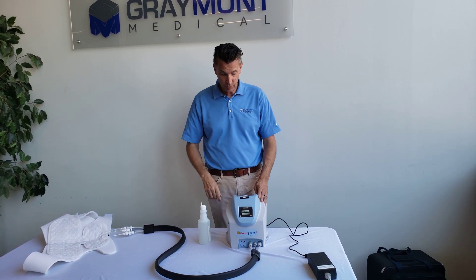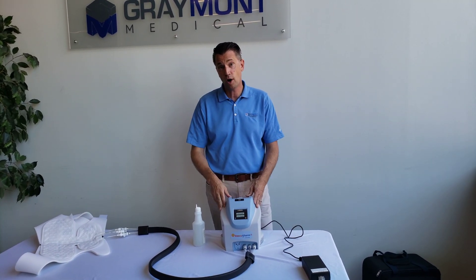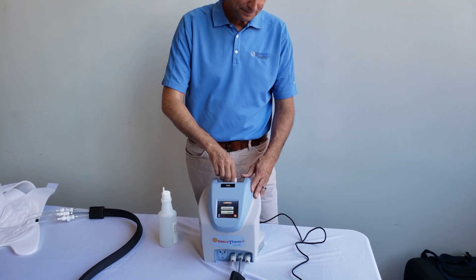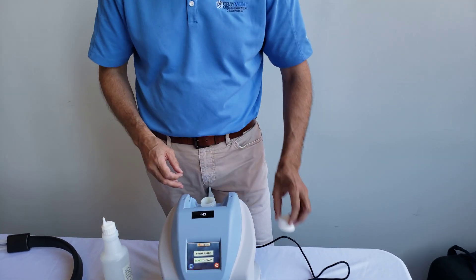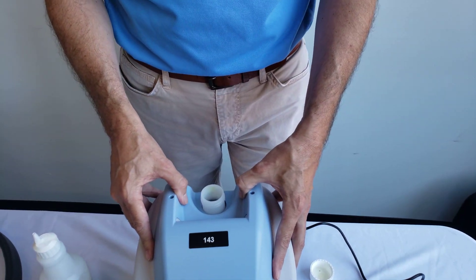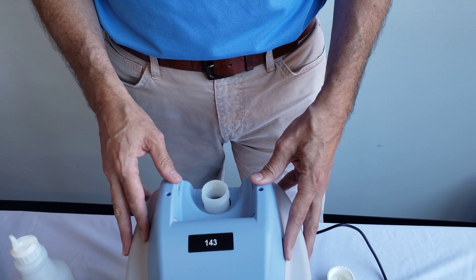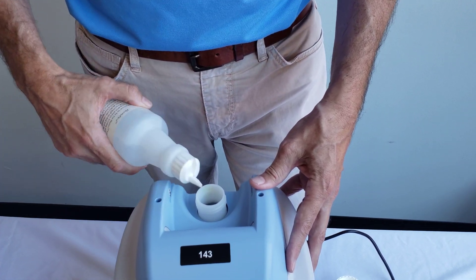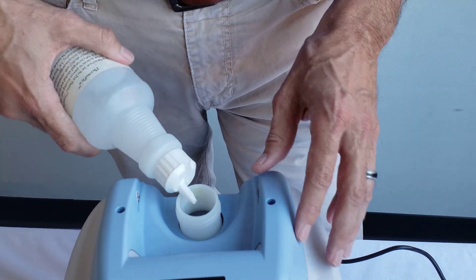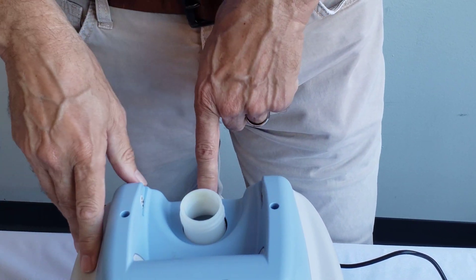The first thing you want to do is check to see if you have enough water in the unit. Remove the cap and when you remove it, look into it — if you don't see any water in there, you definitely need to add some. Take the water bottle and squeeze enough water in there so you see water to the bottom of the neck.